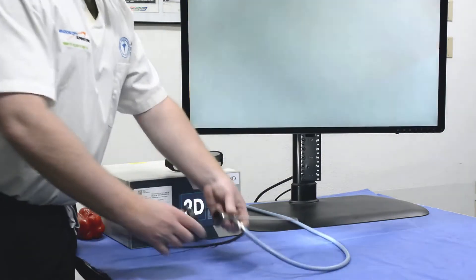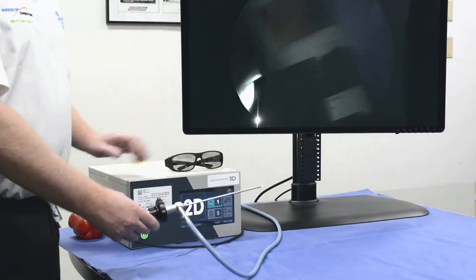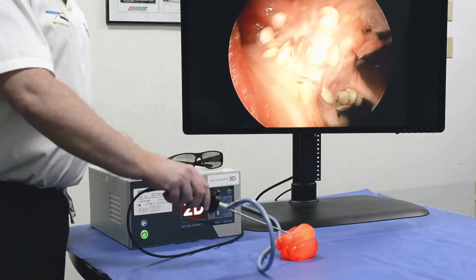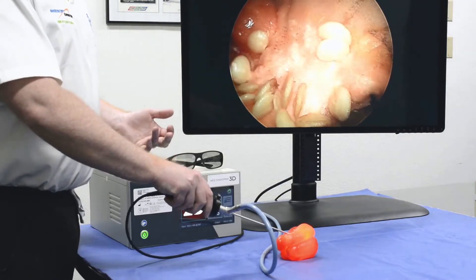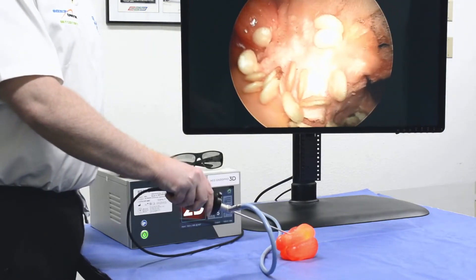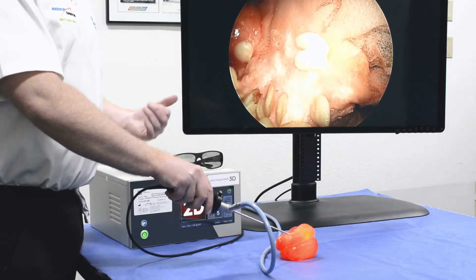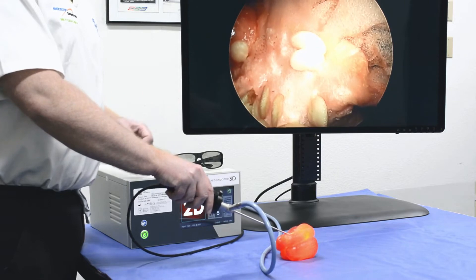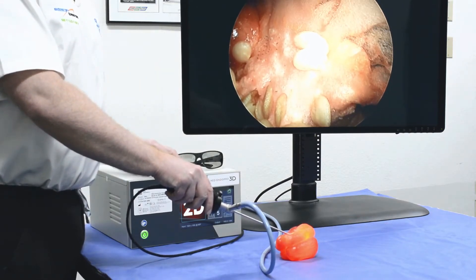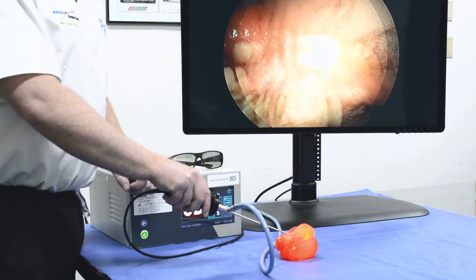The system works by receiving a video feed from the camera system, so we still have regular two-dimension. This system then uses advanced light detecting algorithms to compute depth information — looking at color, texture, outlines, and so forth. That information is then applied to the 2D image, and then with the touch of a button, we're able to split it.